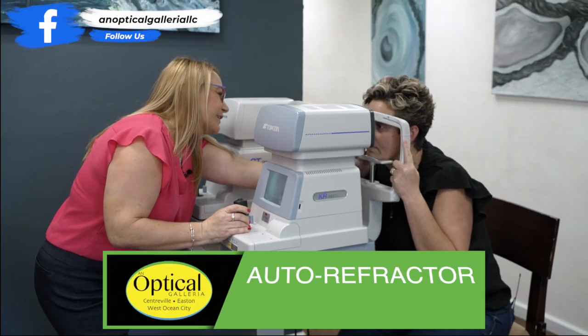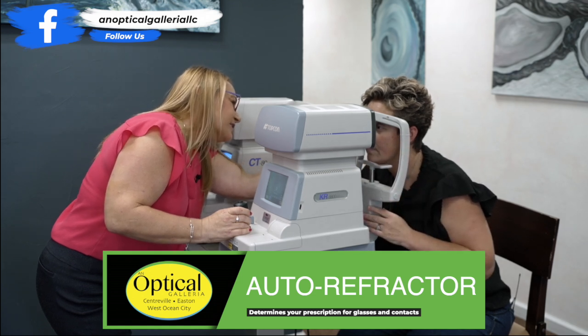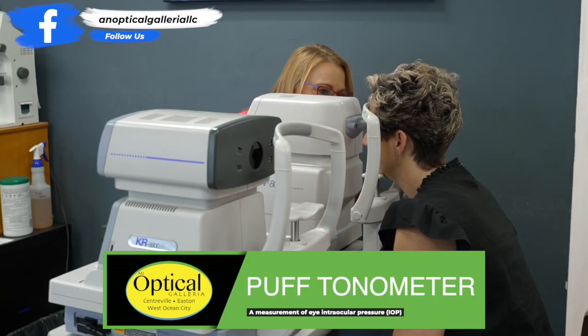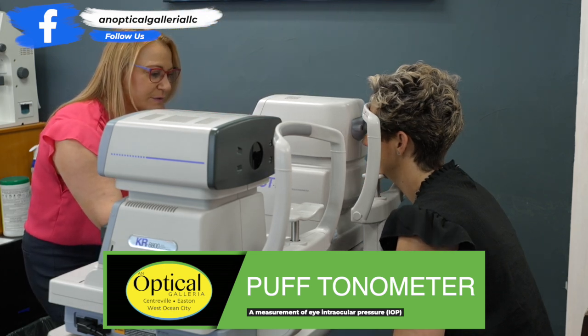Alright, chin in the chin rest there, forehead straight forward and I'm gonna need you to move your hands so that I can adjust this and just rest your hands down by your side. Stay nice and relaxed. Forehead forward, a little puff of air here. I'm just gonna adjust it just a little bit. Try to breathe and relax. Relax your shoulders, straight ahead for me. There you go. Right there, hold still.